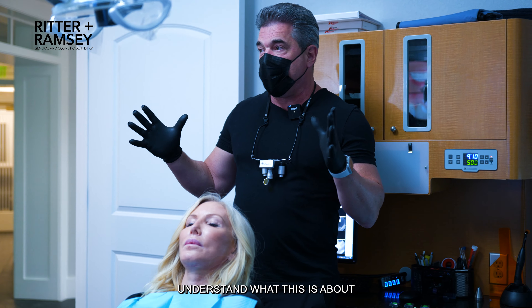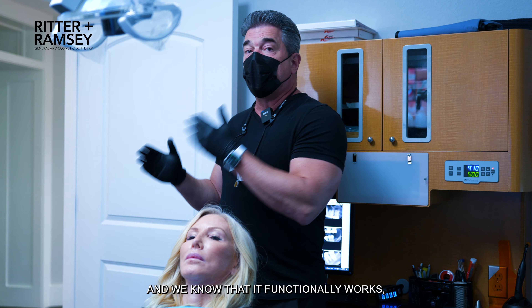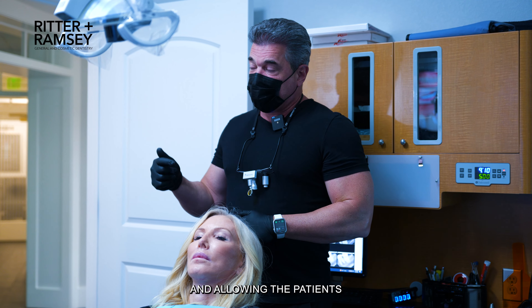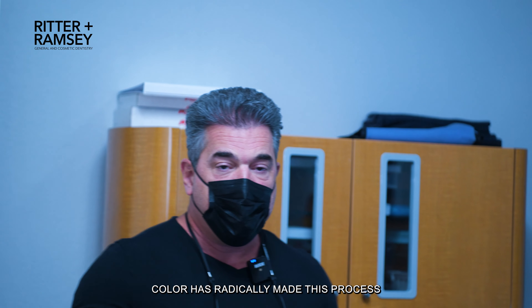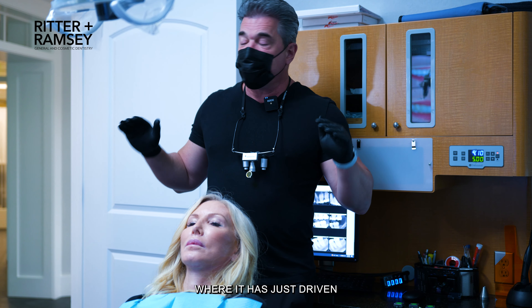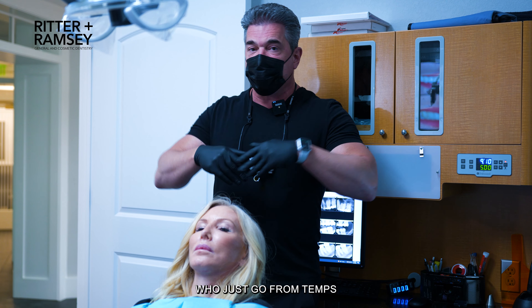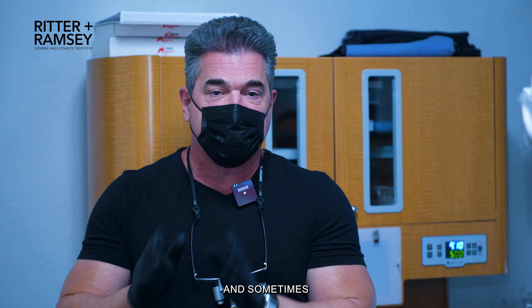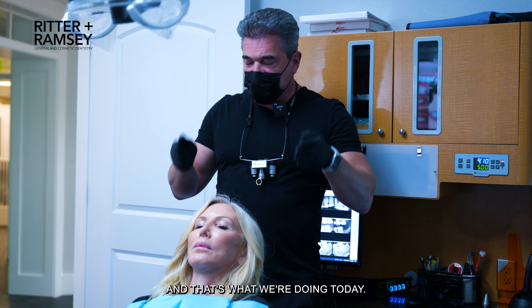Understand what this is about: taking temporaries to the point where the patient has made the adjustments they want, they're comfortable, and we know that it functionally works. Allowing the patients to pick their own color has radically made this process dramatically different, to a point where it has driven our success in comparison to others around our area who just go from temps straight to the finals, and sometimes patients are a little let down. We wanted to eliminate all of that, and that's what we're doing today.